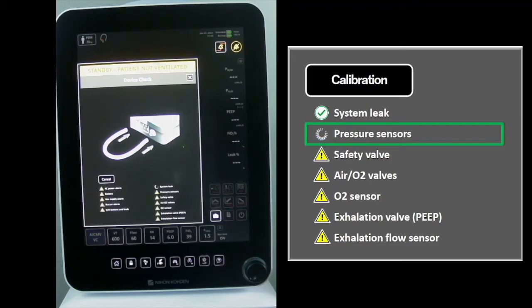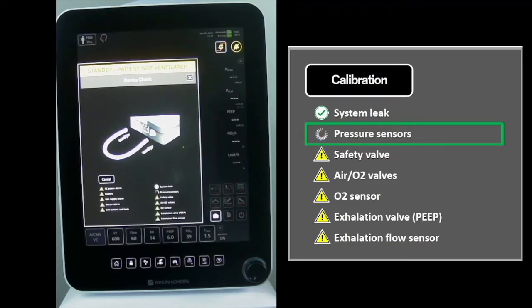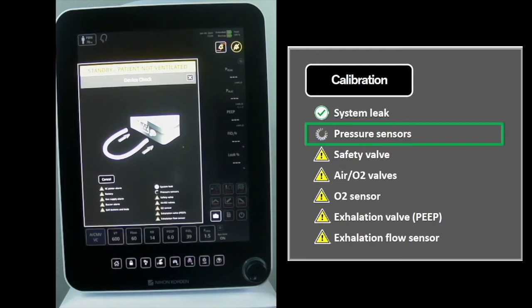Pressure Sensor Test: The P1 and P2 transducers are auto-zeroed. Both transducer pressures are measured and compared. Pressure differences must be within 2 centimeters of water.